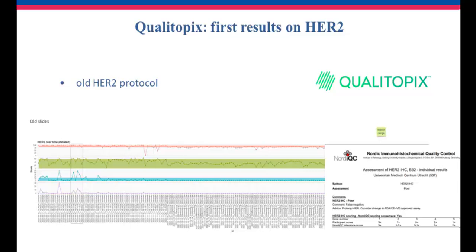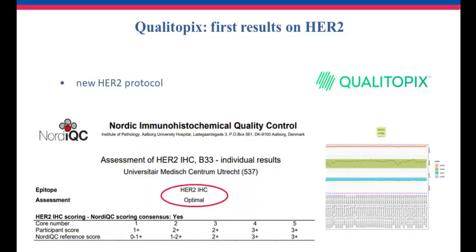So what we then did is we replaced the antibody. After that, you see that the results were much more stable, almost flat lines for the 3 plus, 2 plus, 1 plus, and 0 plus. We did the Nordic control again, and we scored optimal. So I think this shows that you can detect the problem, you replace the antibody, and then you fix the problem.